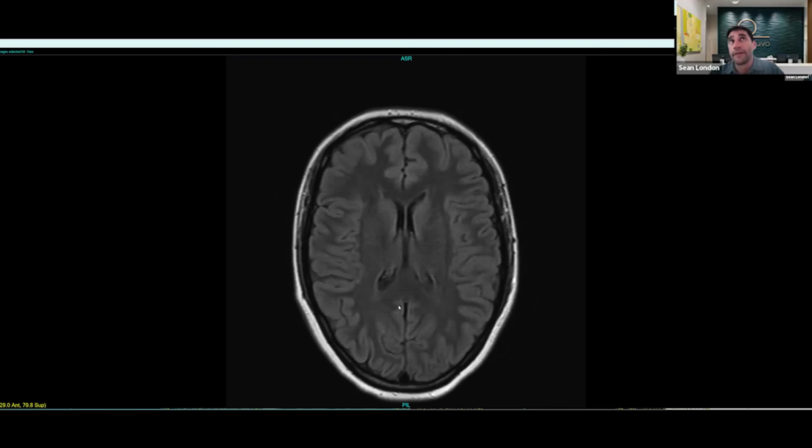And the thing too, when you're getting into the indeterminate category, like 3 that you were talking about, it doesn't necessarily mean that we don't know what it is, but it may not have a typical appearance of a very benign lesion that we're used to seeing. We might want to do either a short follow-up or a dedicated image to confirm what we're thinking, because we don't really want to take much chance here. We really want to provide the best care that we can, and provide the most accurate and relevant information from the image that we have.